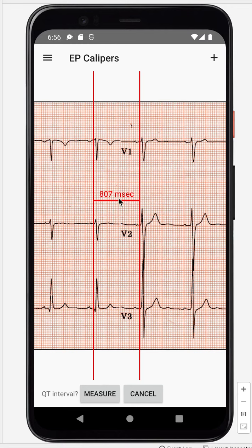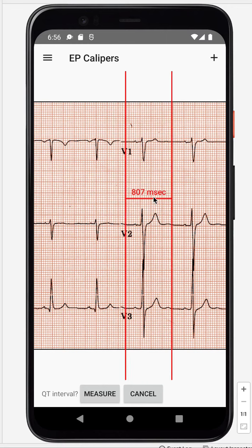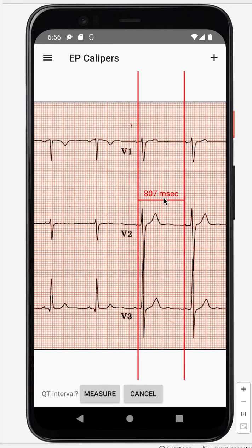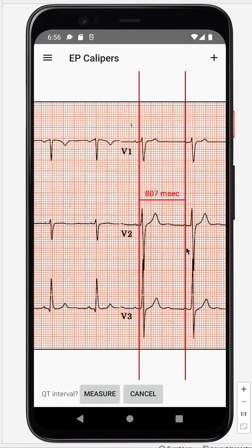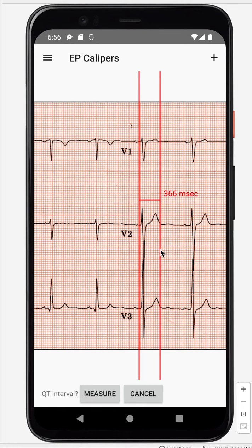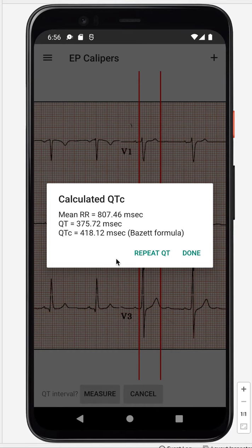Now we have to measure a QT interval — we'll just take this one over here — more or less like that. Hit Measure, and here we have the QTc interval using the Bazett formula. And that's about it.